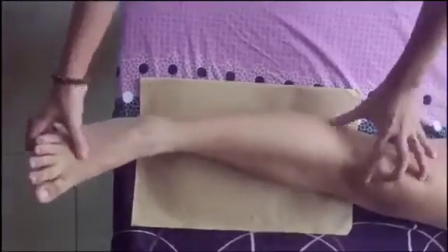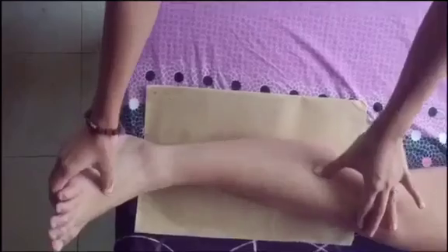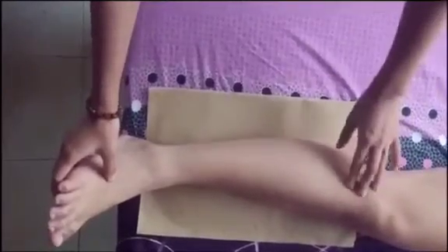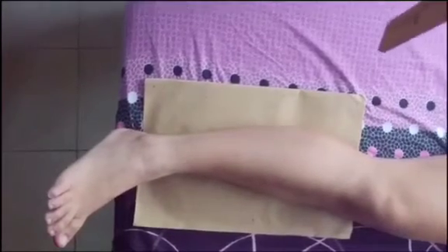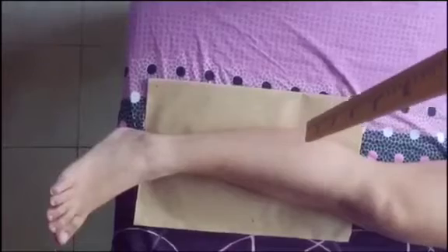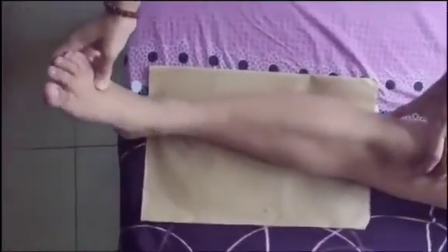Here we're going to demonstrate the proximal and the distal tibiofibular joint. And our central ray is perpendicular to the mid-leg.